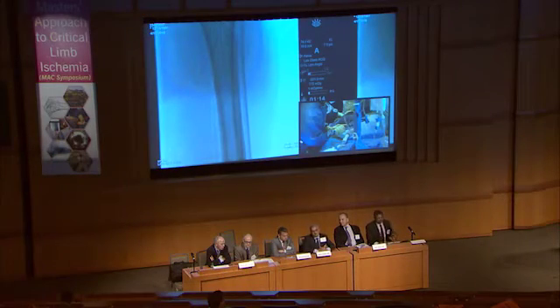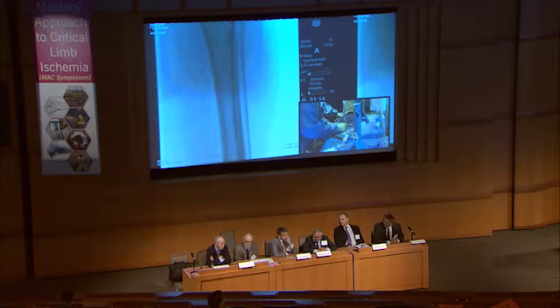But any other ideas, Thomas and Dr. Manzi, John, any other ideas how to deal with this profunda fistula? Well, basically we use soft coils. There are some offered from different companies like Terumo. They can be placed into bifurcations distally, so this is like Onyx more or less. So there are different ways, of course.